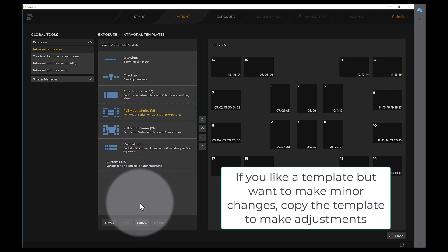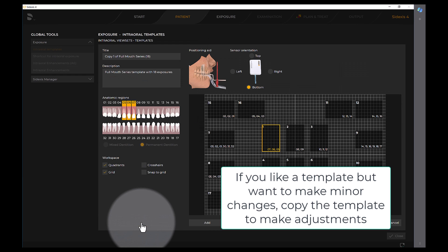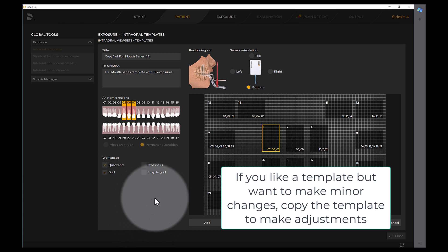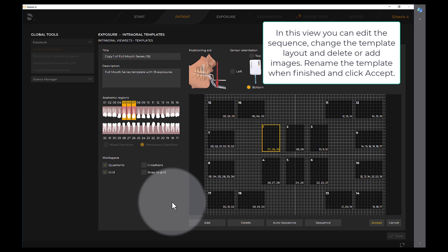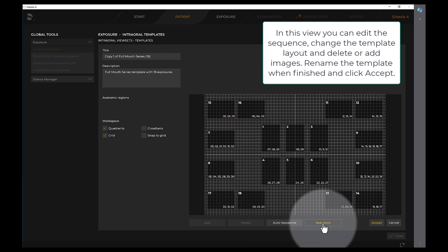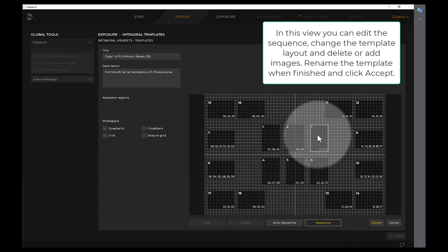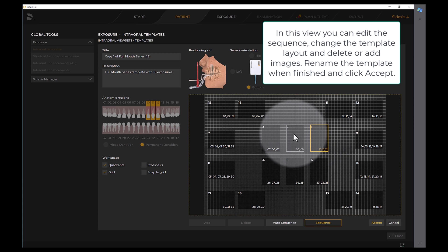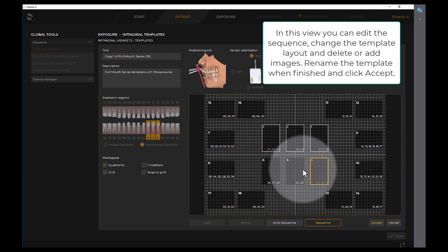If you like a template but want to make minor changes, copy the template to make adjustments. In this view, you can edit the sequence, change the template layout, and delete or add images. Rename the template when finished and click Accept.